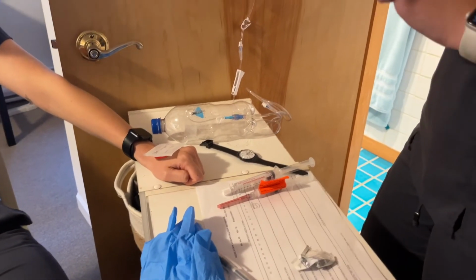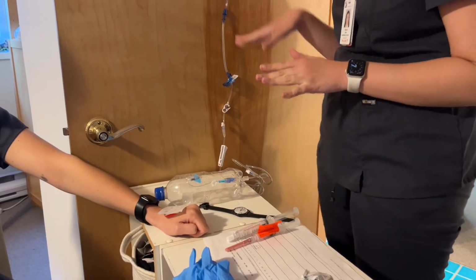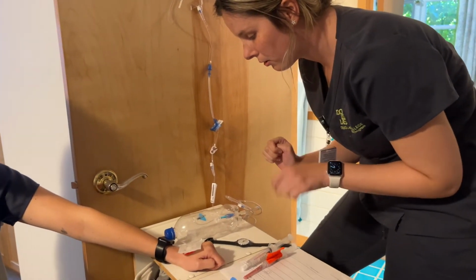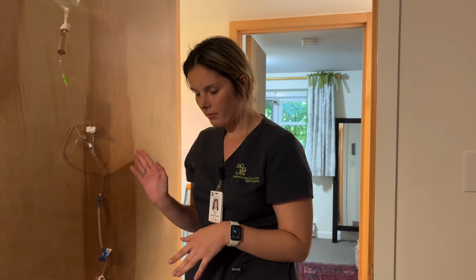Okay, so I'm just gonna do a quick site check just to make sure your IV is good. So looking at the site, do you have any pain still? No. Okay, no redness, no swelling, and it looks patent. And so since the solution is compatible, if it wasn't compatible, I would have to flush before I give the medication and after I give the medication.